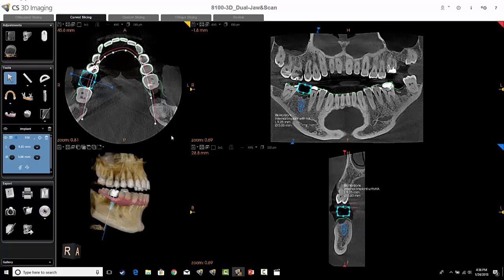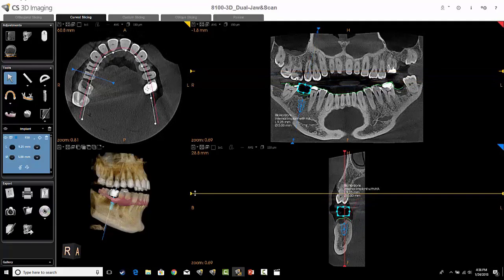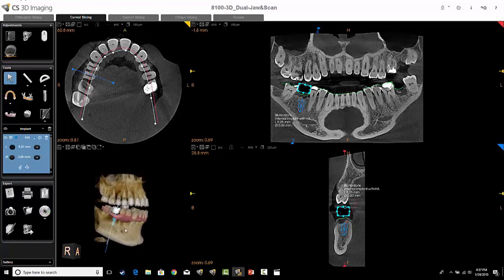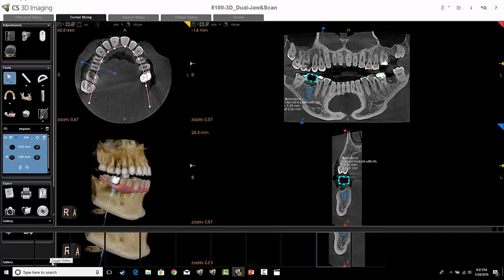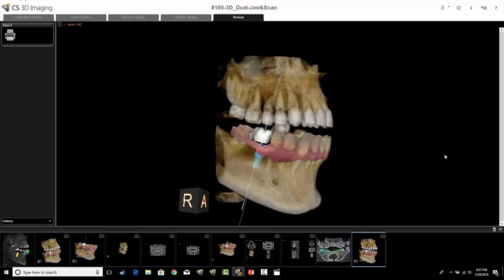If you want each individual image as a JPEG with no side-panel orientation views, you can do that as well. There's a drop-down arrow next to each of the views with a little camera icon. If you wanted a particular view as a JPEG, select the drop-down and select the camera icon. That puts that JPEG image — indicated by the camera icon — down in the gallery with no orientation view, and now you can use it in other applications, Microsoft applications, or emails.